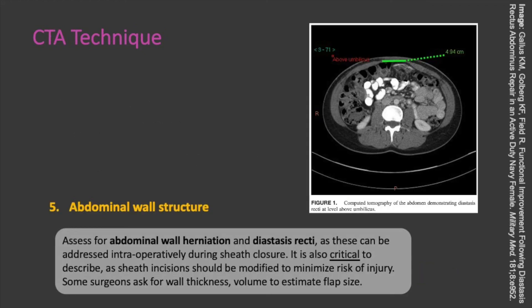The final step in CTA interpretation is assessing the abdominal wall structure. You want to look for abdominal wall herniation and diastasis recti, as both of these issues can be addressed intraoperatively during sheath closure. It is also critical to describe these findings, as sheath incisions should be modified to minimize risk of injury to underlying bowel. Some surgeons ask for wall thickness or volume to estimate the flap size.